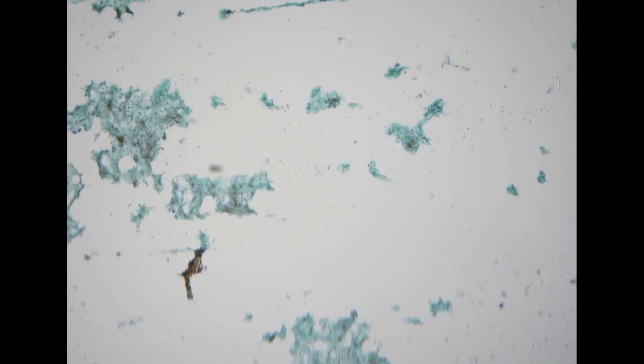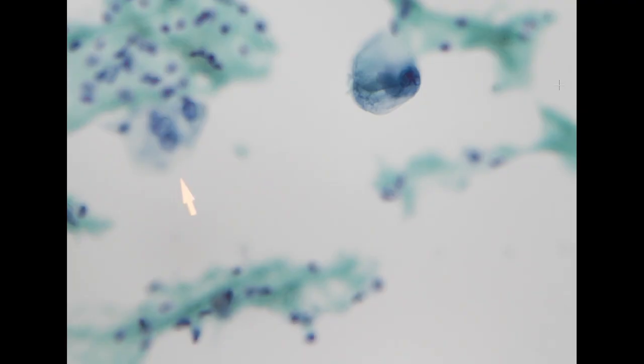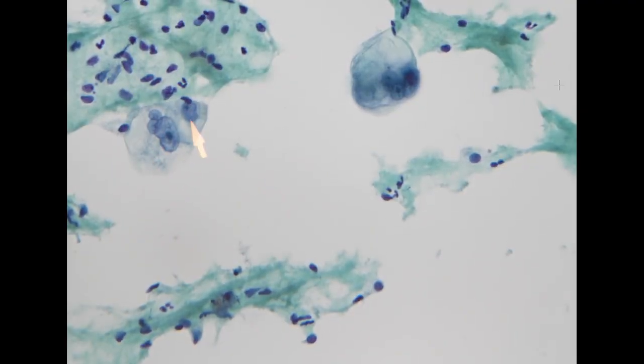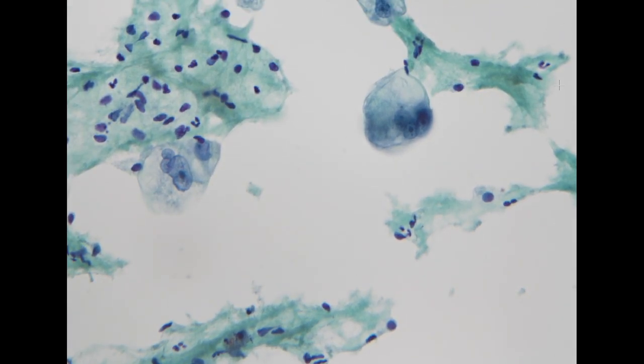So this specimen is also coming from a pleural effusion, but the patient doesn't have lung cancer. She has pancreatic cancer. So we see very scattered but very high-grade adenocarcinoma cells with highly vacuolated cytoplasm. So this is compatible with metastatic pancreatic cancer, high-grade.